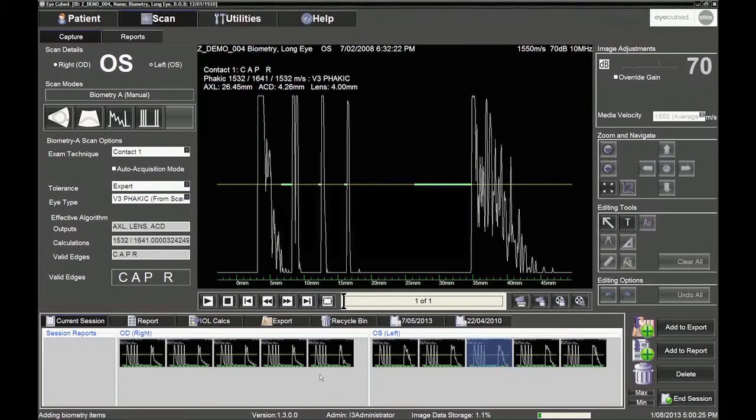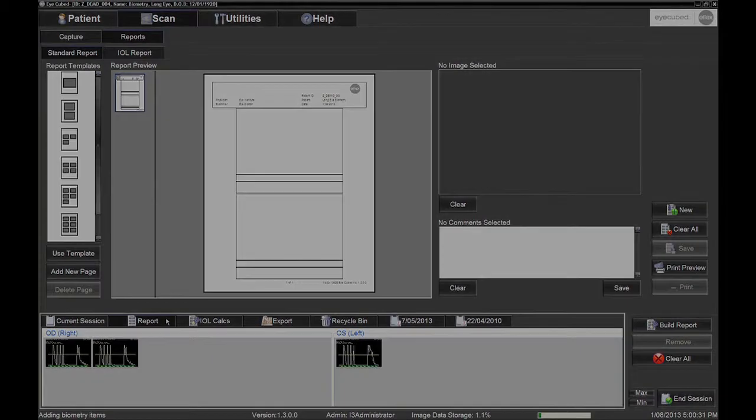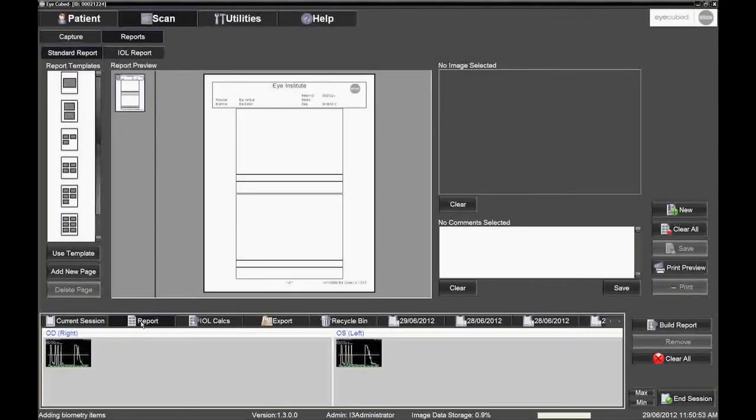Click on the Report tab located above the image trays. The images which were chosen for the right and left eyes will be seen in the trays. To print the biometry scan without the IOL calculation, proceed with the following.